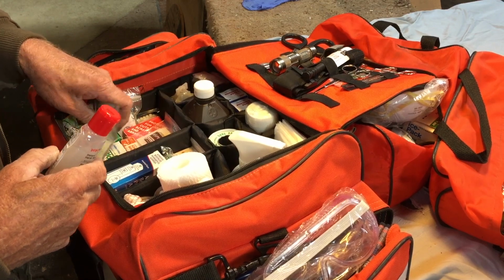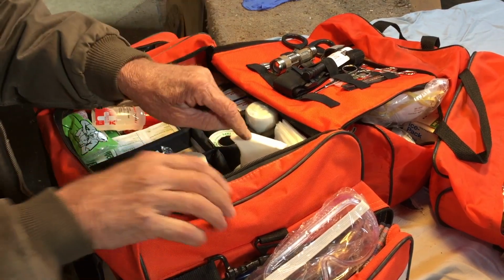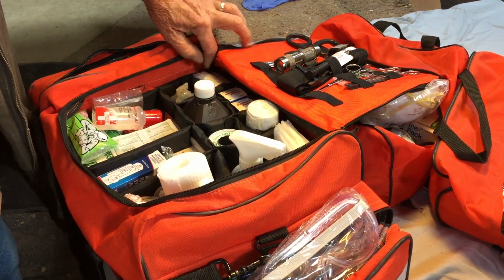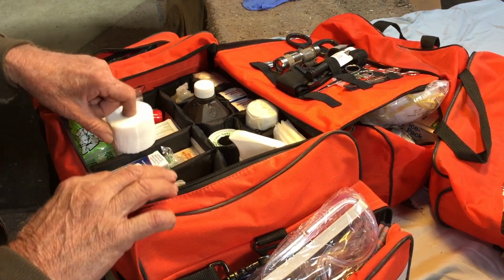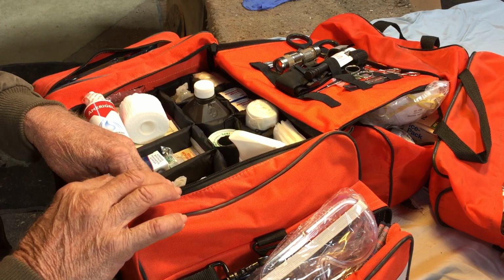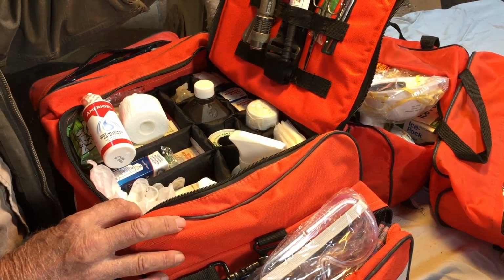various other types of medicines, aspirin, eye wash, hydrogen peroxide, bunch of different adhesive tapes, wound wash, alcohol, 6x6, another ACE bandage, gauzes, Kleenexes, regular bandages, hand sanitizer, another wound wash, non-vinyl surgical gloves, 2x2s, compressed dressing, and more sterile pads. And obviously all the instruments are up here.